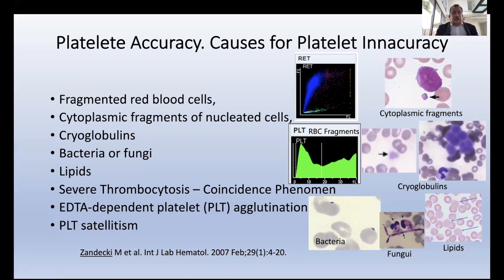Last but not least, severe thrombocytosis is a cause of inaccuracy — not thrombocytopenia but thrombocytosis — where some instruments don't count platelets well at high values. Even if the operations manual states linearity up to one or two million, when you dilute the sample 1:3 or 1:5 and multiply back, you will often not reproduce the first count. This represents a coincidence phenomenon where two or three platelets appear as one because they are too numerous, a known phenomenon since the time of Wallace Coulter and the first automated hematology instruments.